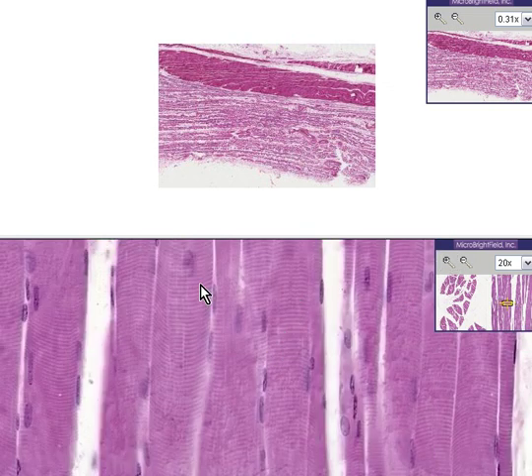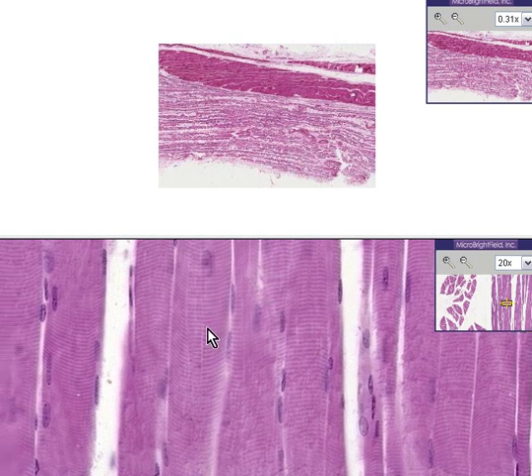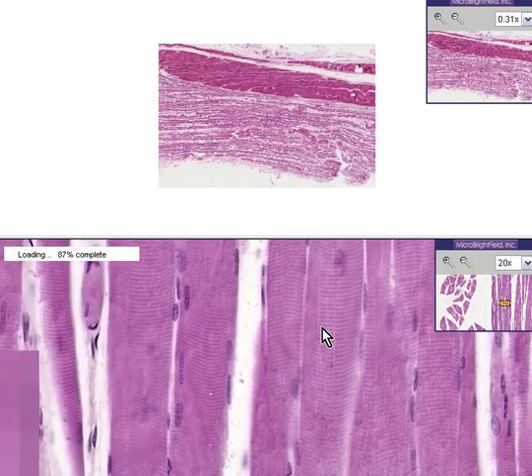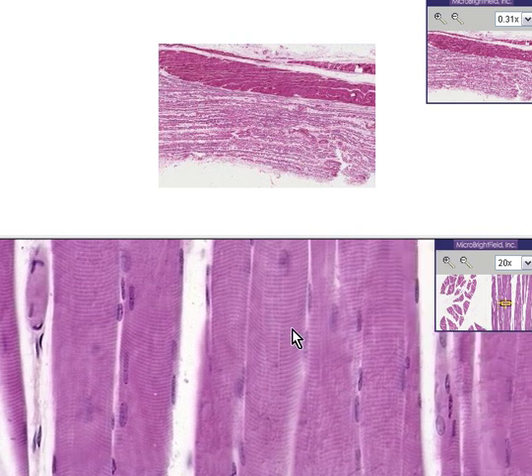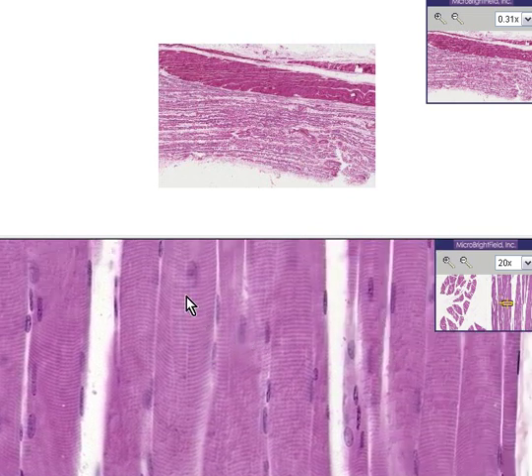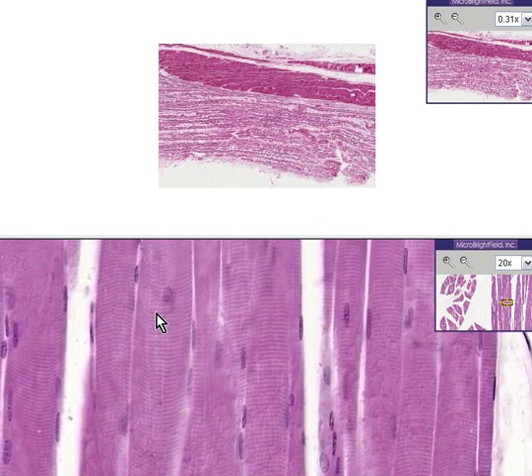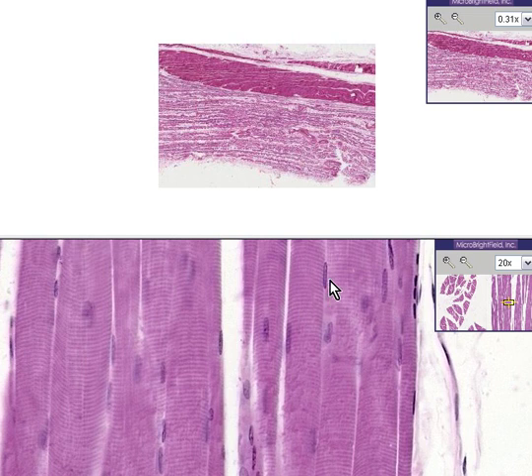You can very easily see the striations. The muscle fibers are basically right next to each other, lined up like logs, and you can see that the nuclei are at the periphery of the fiber.